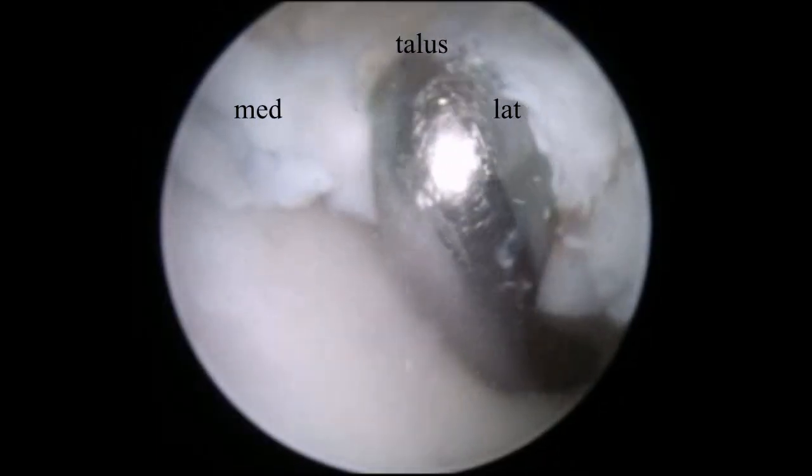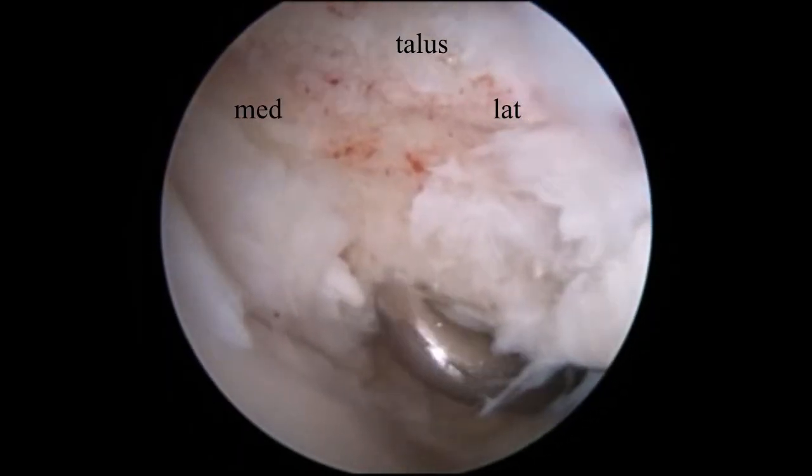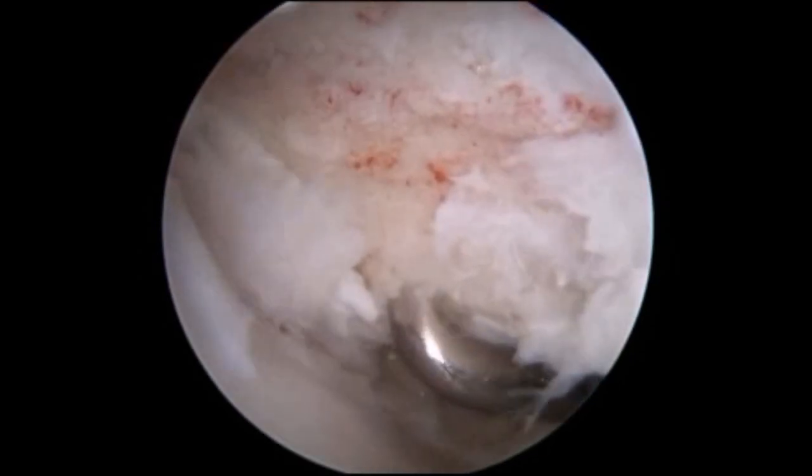But for the shoulder lesion, this is a view from the posterolateral portal. You can use the anteromedial portal for instrumentation.